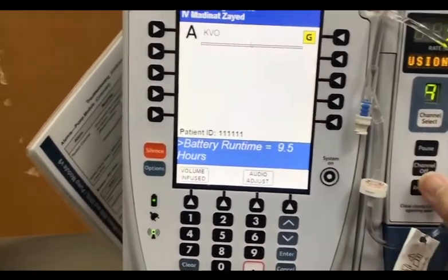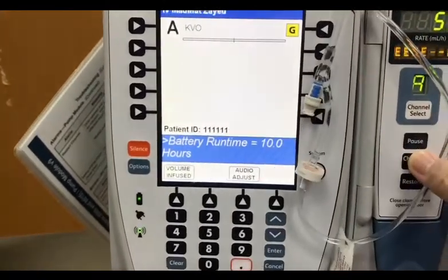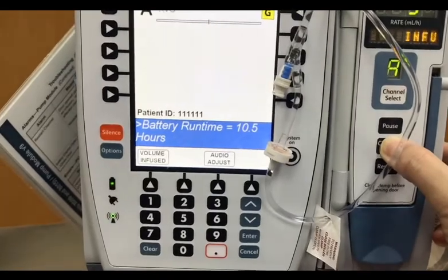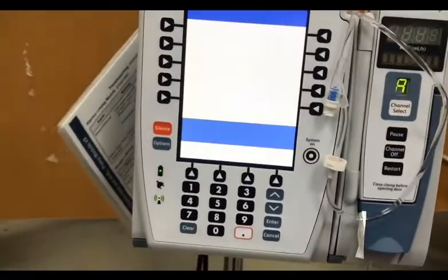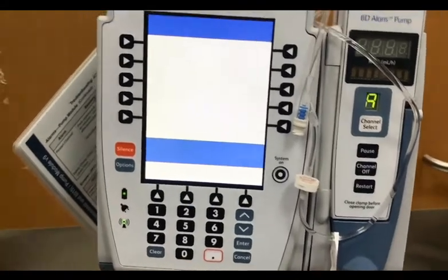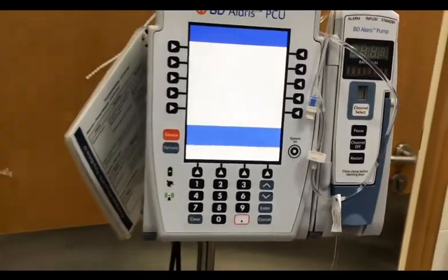Okay, now it's completed. So infusion complete. After completion, you can just switch off, just switch off like that. It will alarm, so you will know that the infusion has been finished.